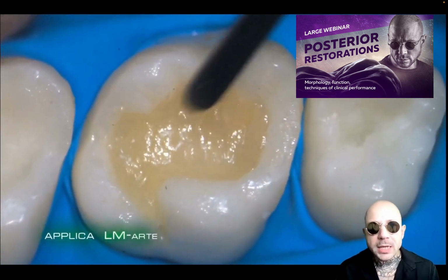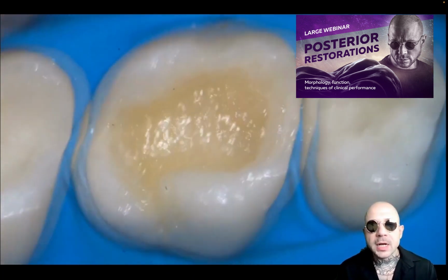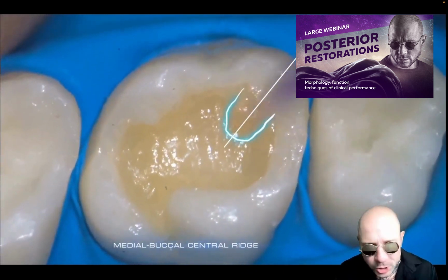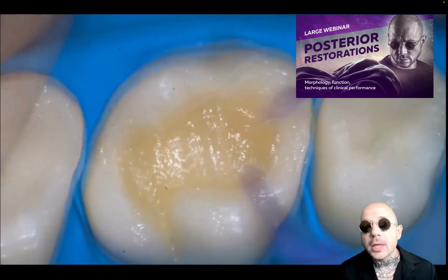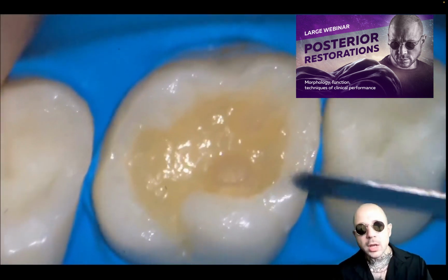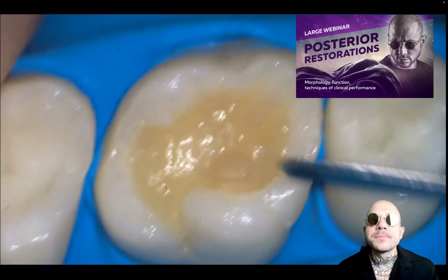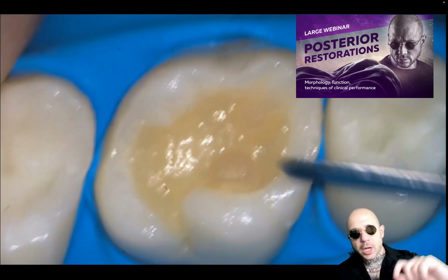So now you see application of portions for reproducing the ridges themselves. You can start with any ridge you want. It's not that big a difference from which ridge you start the modeling, but it should be a central ridge. We need to finish modeling and positioning of central ridges first, because as you remember, central ridges are more important functionally and getting higher to the upper point of the cusp.